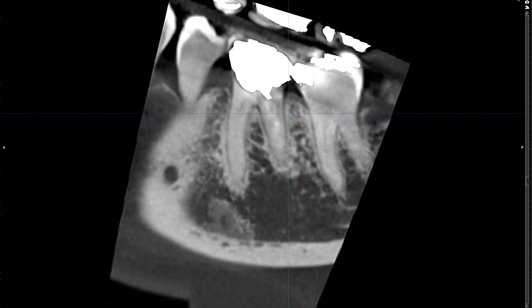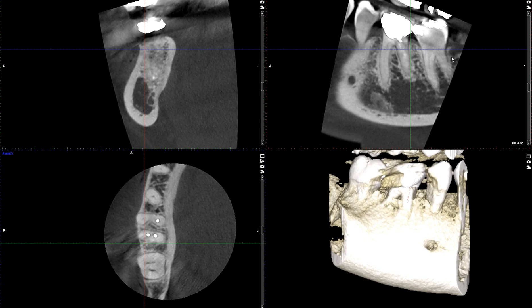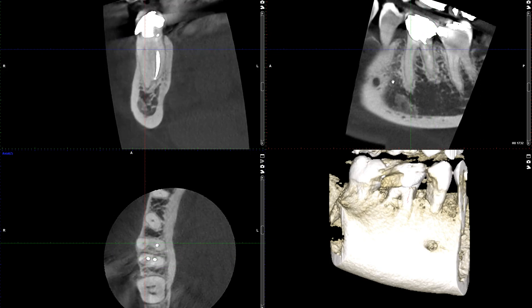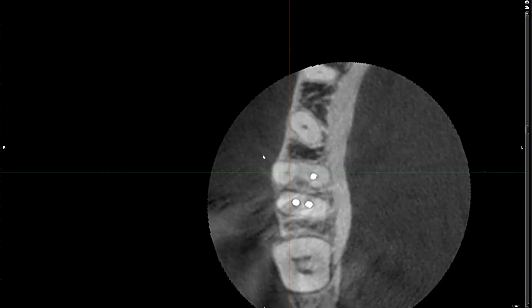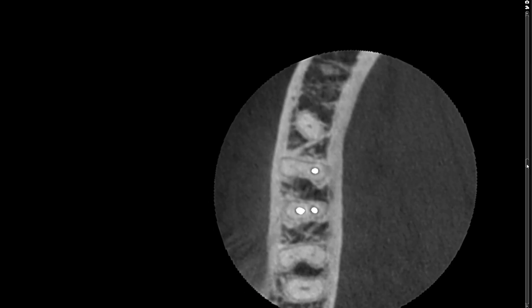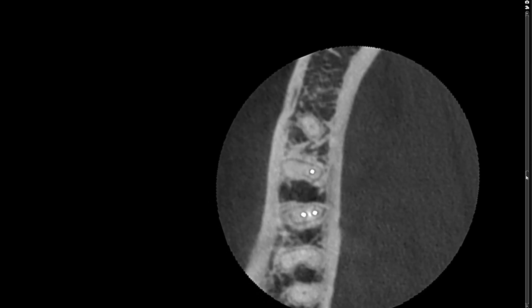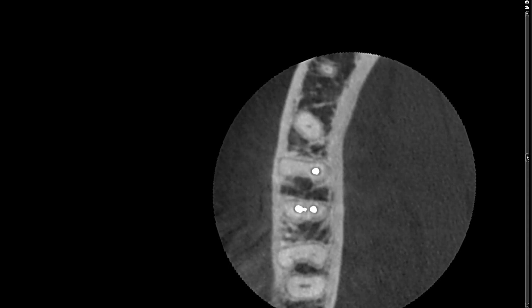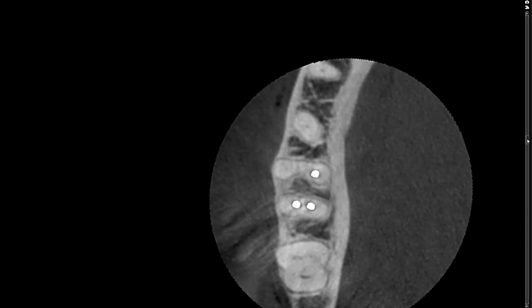By now you should be able to tell what the main issue is. The main issue here is that we have an unfilled mesial buccal canal. The mesial buccal canal was not cleaned and obturated, most likely because it could not be discovered.